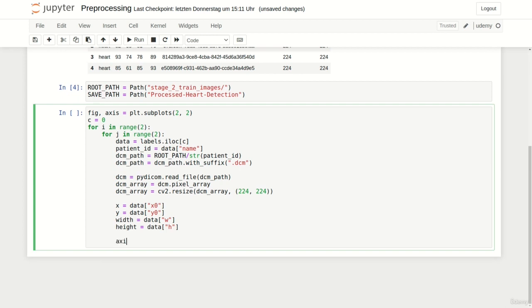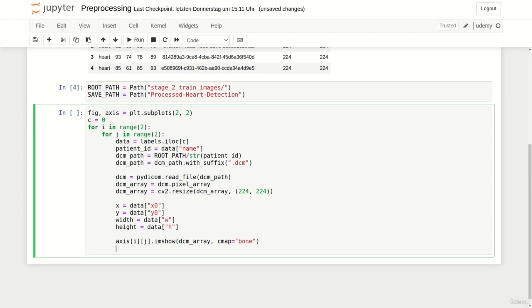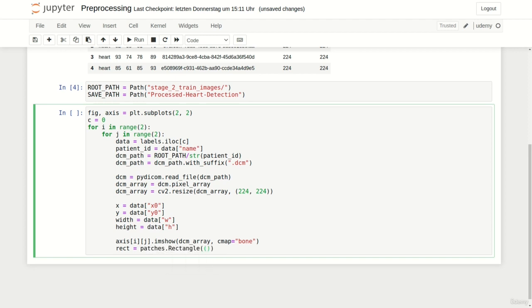Using those two coordinates plus width and height we can now draw the rectangle around the heart. At first we visualize the x-ray image by calling imshow to which we pass the DICOM array and cmap equals to bone. Next we define the rectangle containing the bounding box by calling patches.rectangle to which we pass at first the coordinates of the top left corner in our case the tuple x and y. Second the width of the bounding box and third the height.